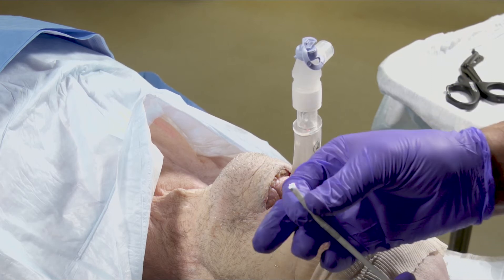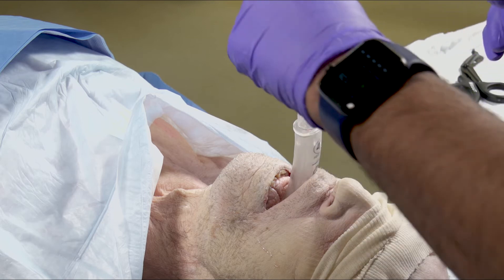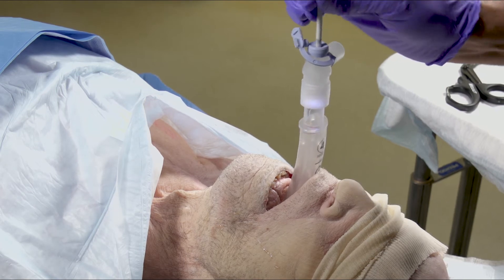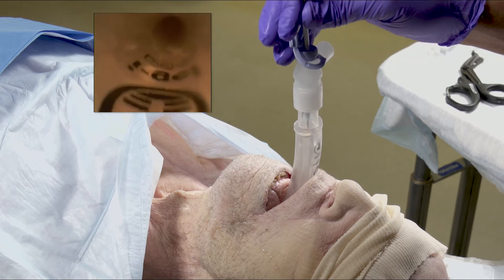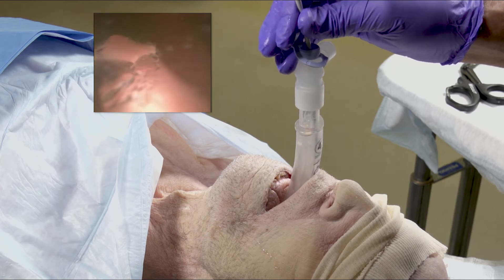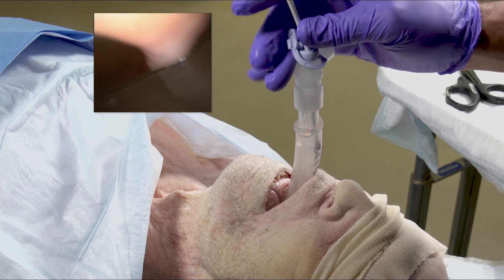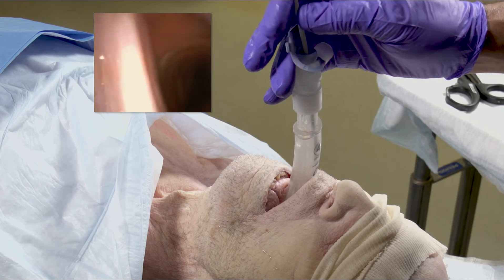Apply lubricant to the distal sides of your scope. Insert the bronchoscope tip through the bronch adapter attached to the iGel. Advance the scope to the level of either main stem bronchus while trying to keep your target in the center of your screen.